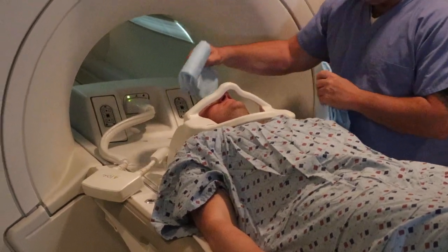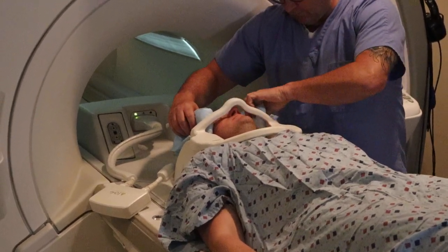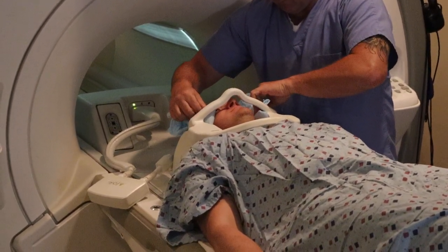For patients that are heavier, you might not be able to get that anterior bridge on. It's okay to essentially scan without the anterior bridge.